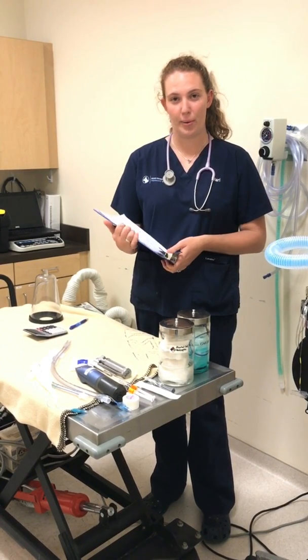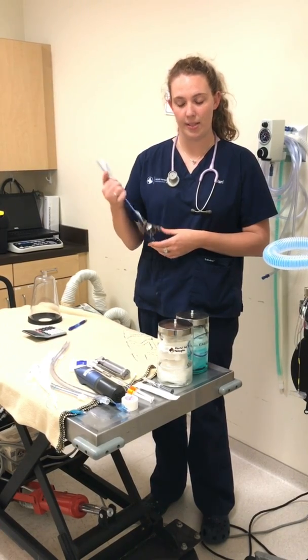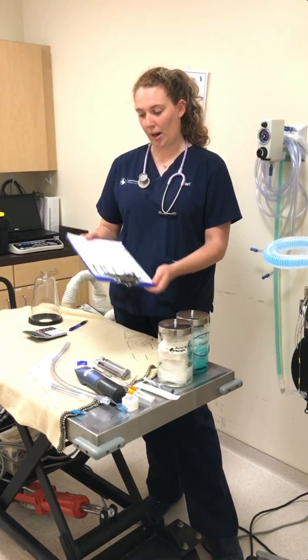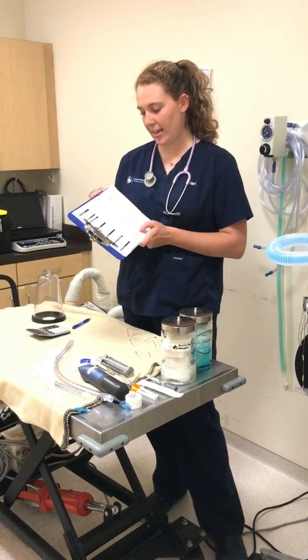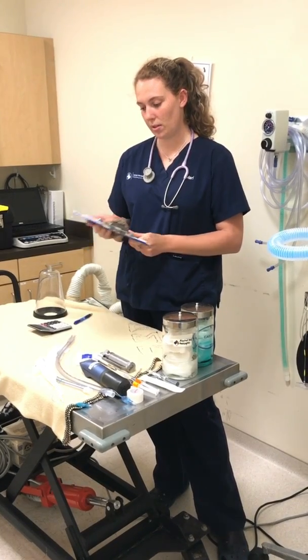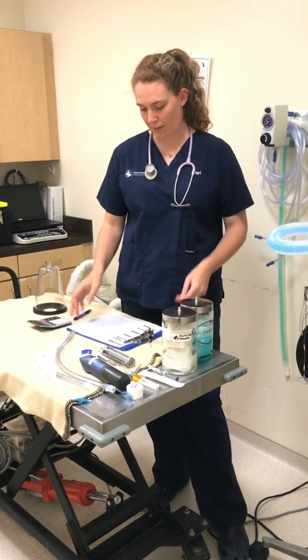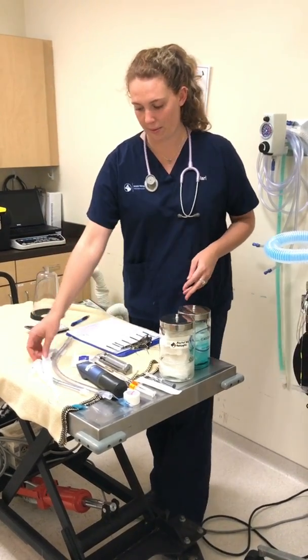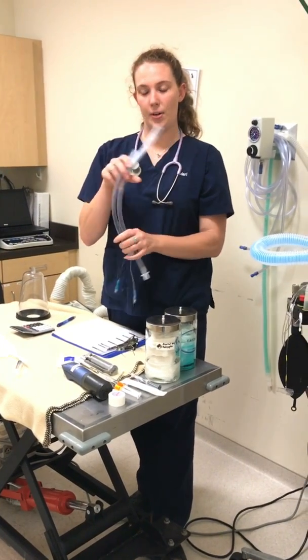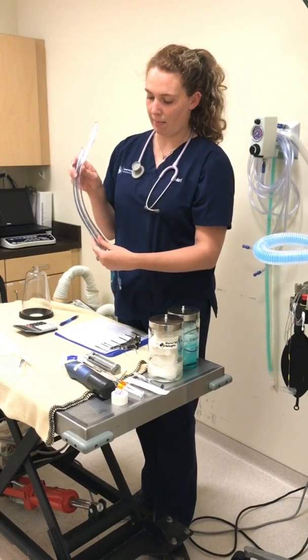Task number 3, preparing our anesthetic equipment prior to induction. We are going to be performing an MRI scan on Kinsey, a 10-year-old female spayed Labrador Retriever weighing 30 kilograms. We go ahead and make sure that we've got all of our equipment here. So we've got 2 ET tubes of the appropriate size for Kinsey. We've got an 11 millimeter and a 10 millimeter.